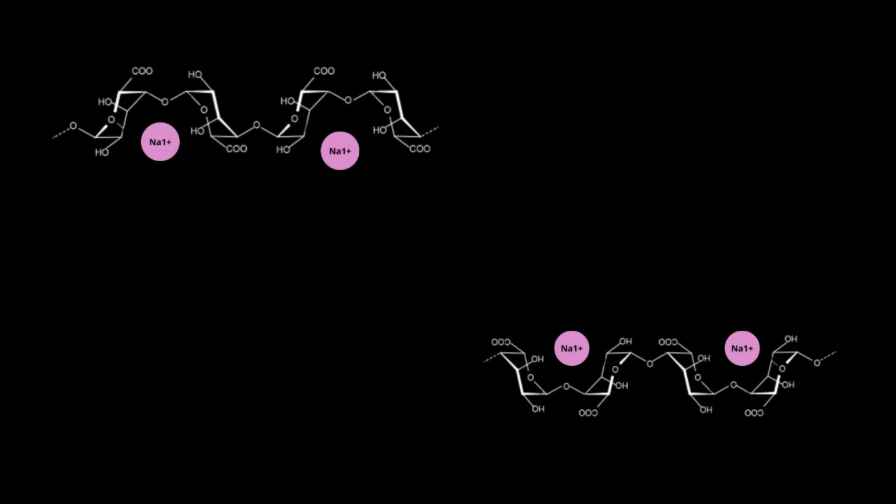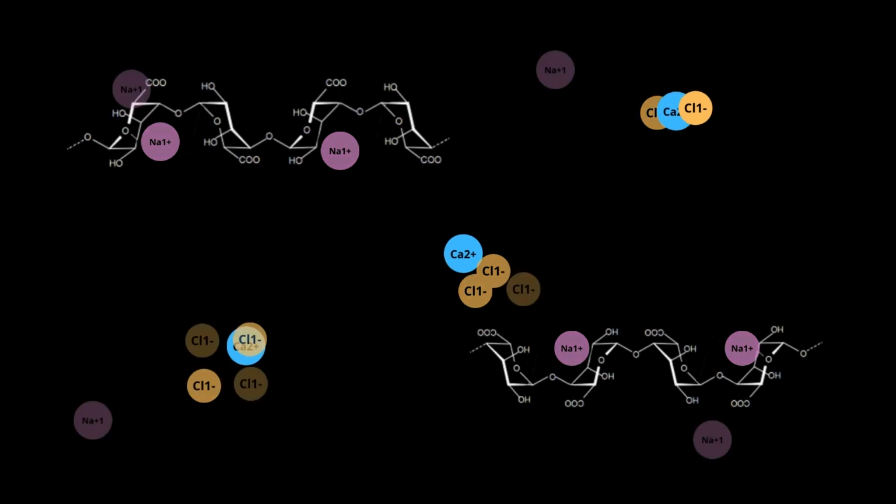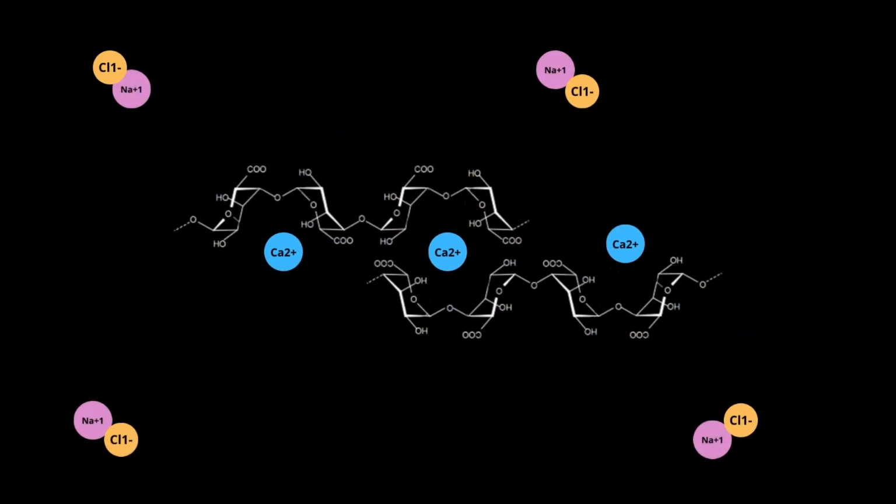The chemistry behind the spherification system is a relatively simple polymerization reaction. The sodium alginate and calcium chloride react instantaneously at 37 degrees Celsius to form a calcium alginate polymer chain, which envelops the cells. Sodium chloride is the sole byproduct of this reaction, making it appropriate for stem cell culture. The resulting spheres, now containing the mouse embryonic stem cells, are characterized by a semi-permeable membrane, allowing for the spheres to be submerged in media.